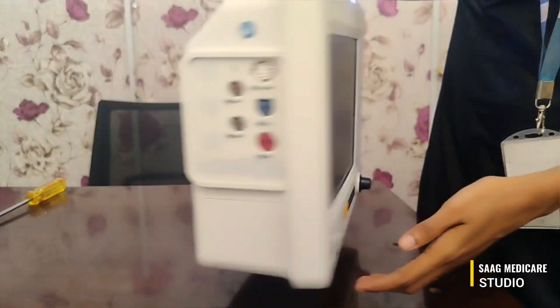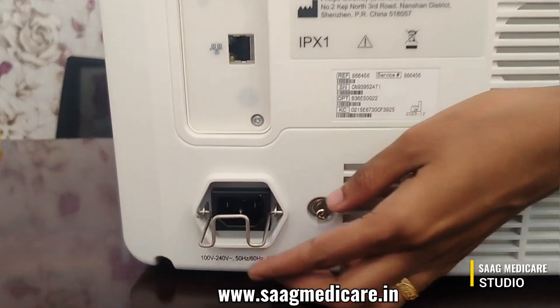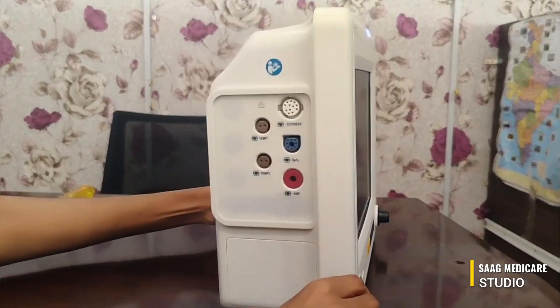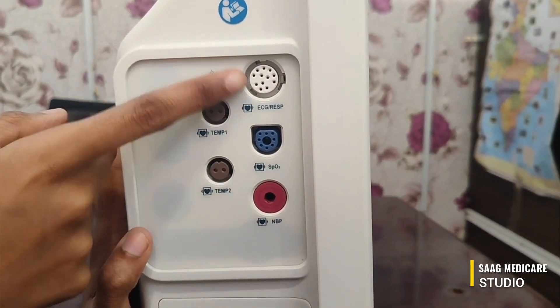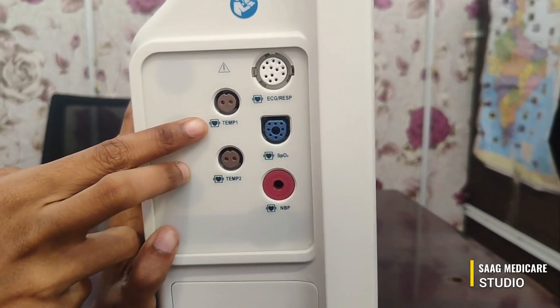On the back side of the machine we can connect the AC input. On this side of the machine we can see the ports for connecting probes: this is for ECG, this is SpO2, this is NIBP, and this is for temperature.